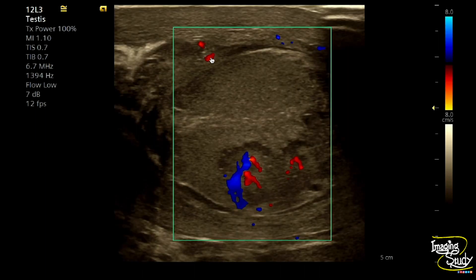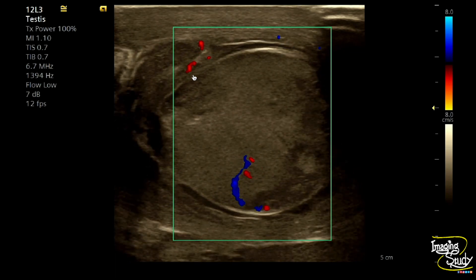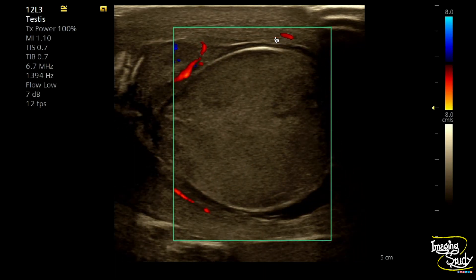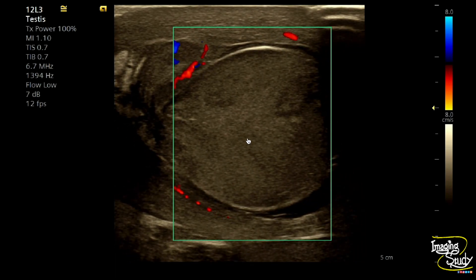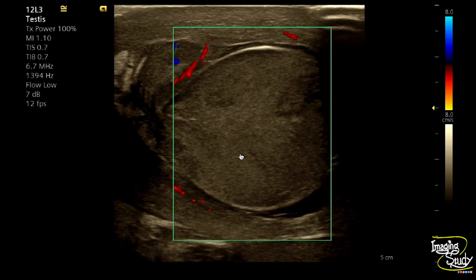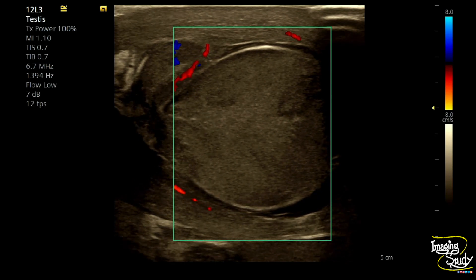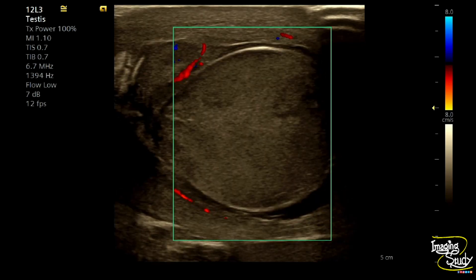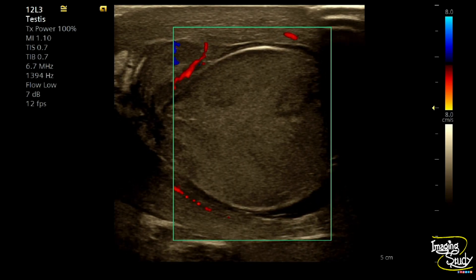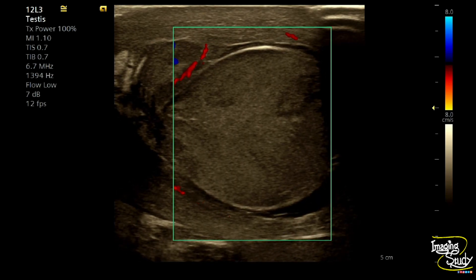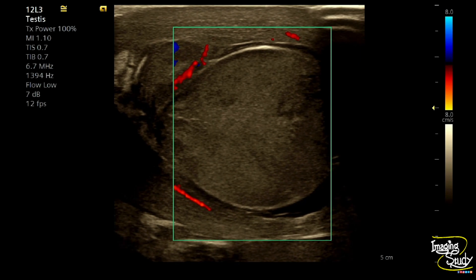On color Doppler you can see increased vascularity at the spermatic cord level. But when we move into the testis, there is no vascularity within the parenchyma, except for the necrosed areas which are showing a good amount of flow within. The peritesticular flow is increased but there is no flow within the testicular parenchyma.